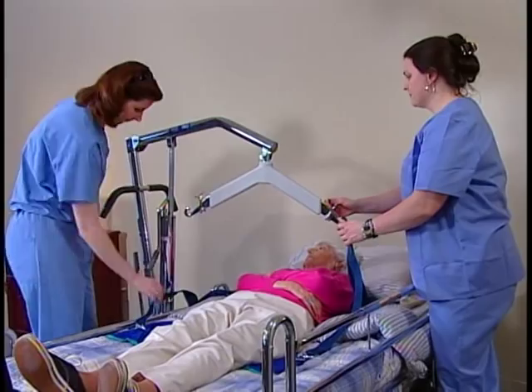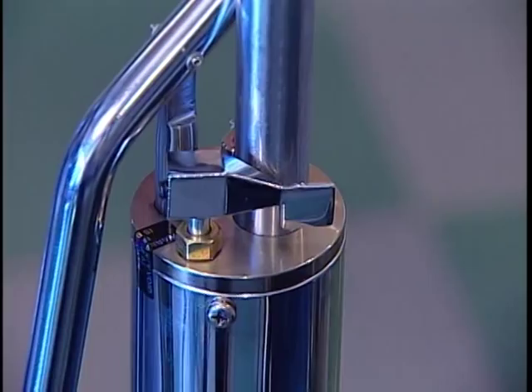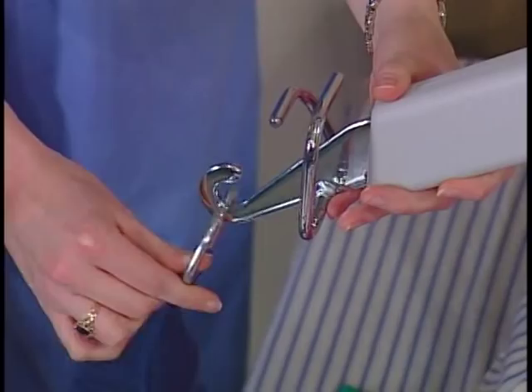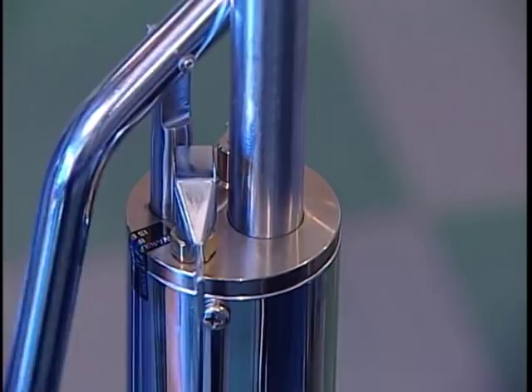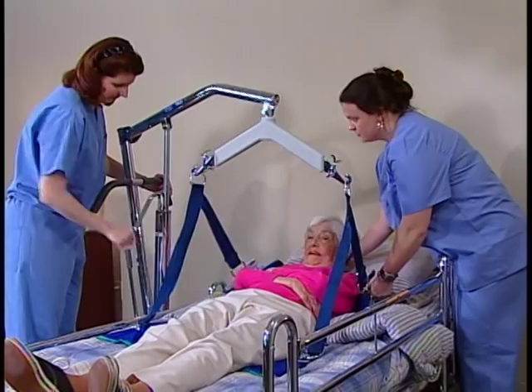Attaching the sling to the swivel bar is a crucial step — if not done right, serious injury can result. Turn the control valve clockwise, then give the unit a few pumps. This will elevate the swivel bar slightly and provide a bit of tension to the sling. Double check to make sure that both of the attachment points of the sling are secured to the swivel bar. If they're not, lower the sling and fix them.